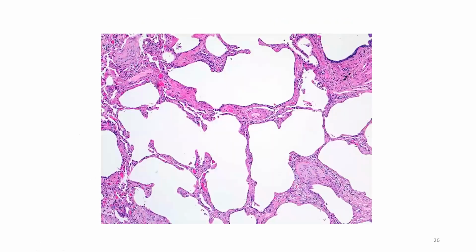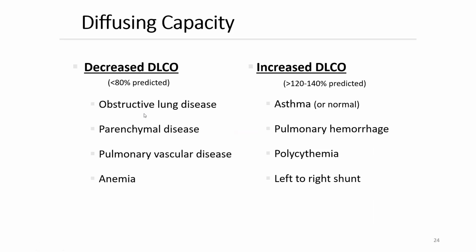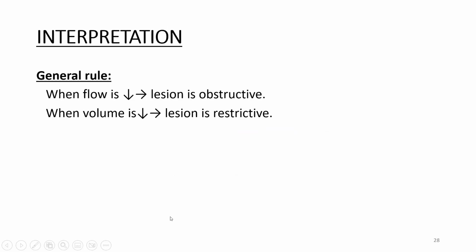We ask for DLCO to differentiate between asthma and emphysema, to evaluate the severity of restrictive lung disease, and to evaluate cases of pulmonary hypertension. However, it is expensive.